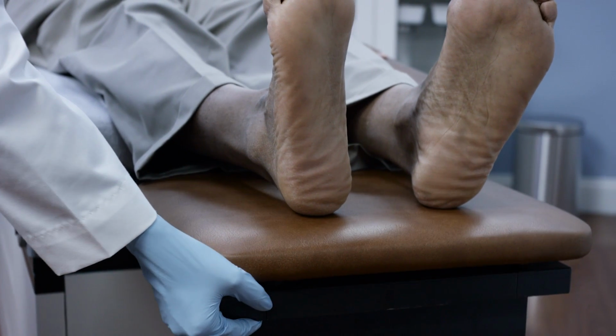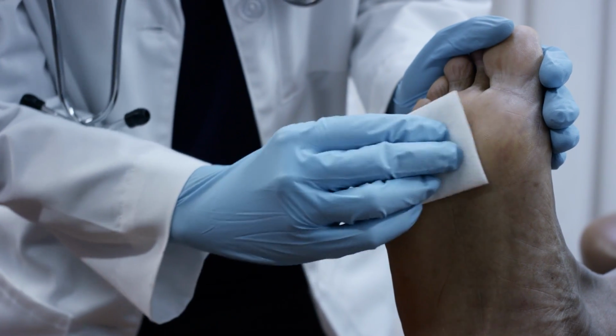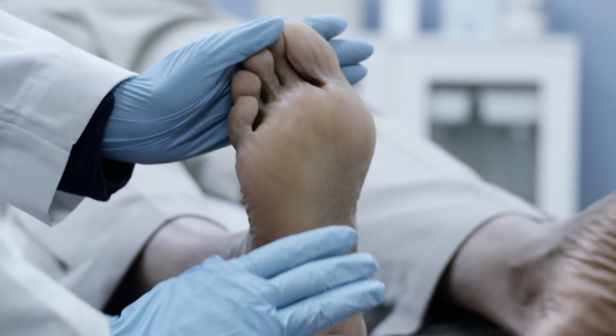First, prepare the patient by identifying the desired imaging location on the body. Next, remove any jewelry or other objects that may obstruct blood flow or interfere with imaging. Clean and dry the region as needed. Ensure the region of interest is properly supported and the patient is resting comfortably.